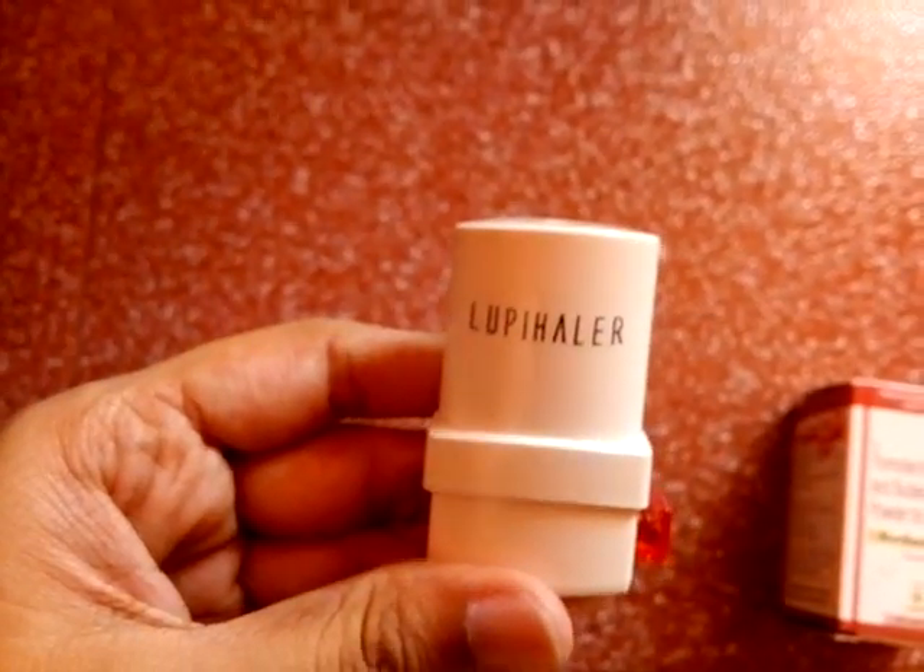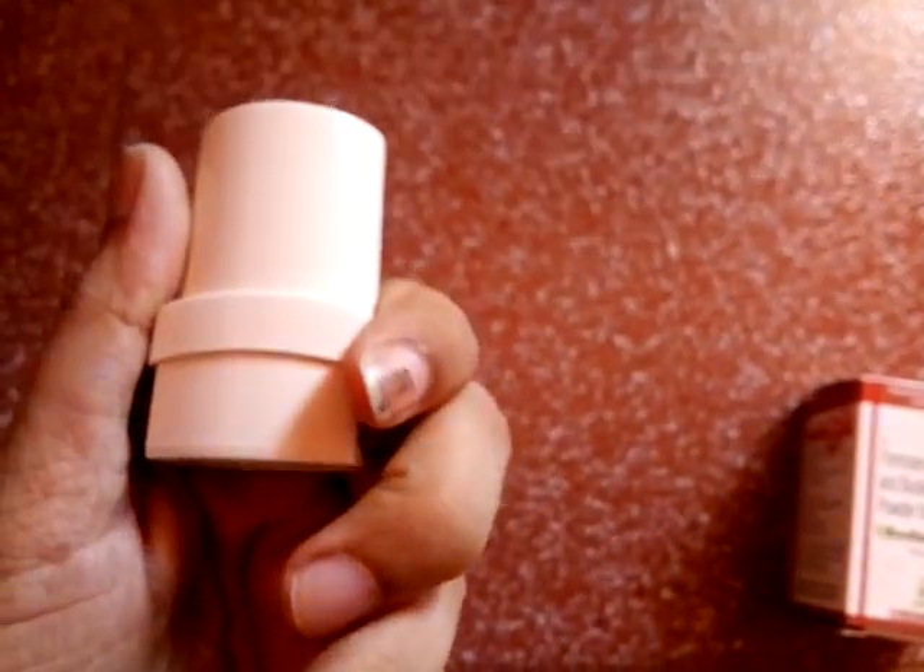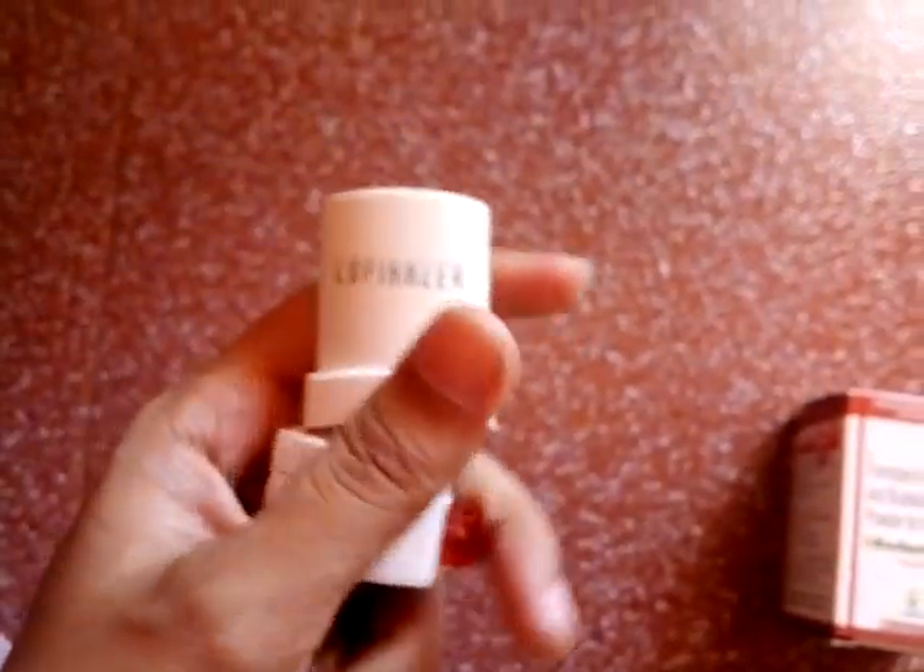Hi, in the last video I promised to show you how to use an inhaler. This is an inhaler — a Loopi inhaler — and it costs around 300 to 400.